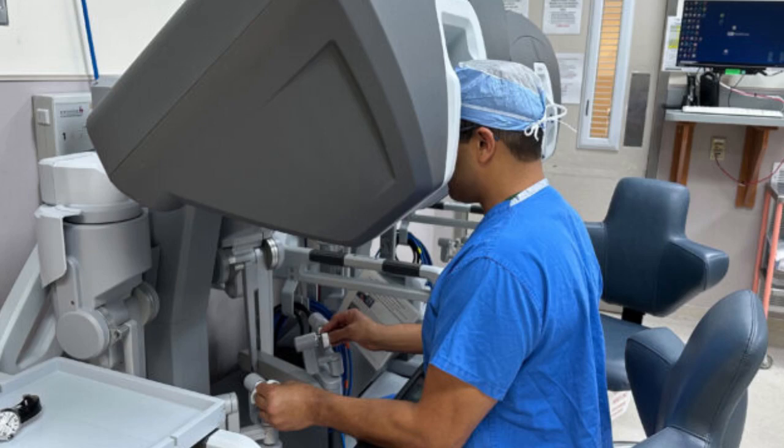While the patient's physical recovery has been on schedule, he did require extra time in the hospital due to cognitive symptoms that are not unusual in older patients after major surgery. The robotic liver transplant took just over 8 hours on the high end, but within the expected time frame for traditional open liver transplants, which usually take 6 to 8 hours. Future robotic liver transplants likely will be completed faster as the OR team gains experience and gets more used to the subtleties of the new surgical technique.